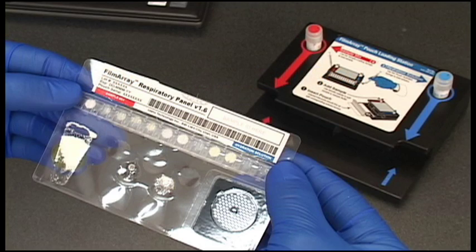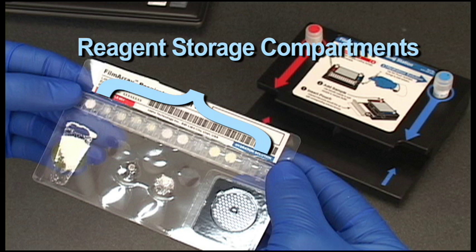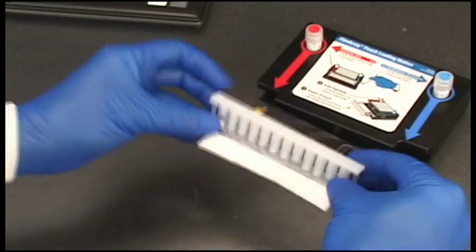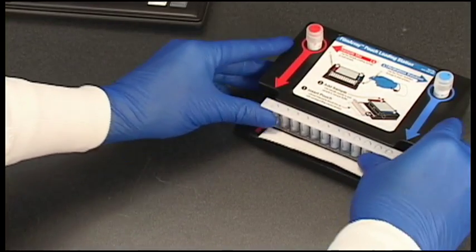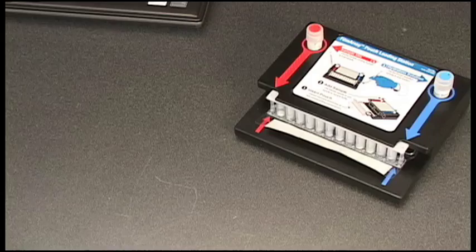Starting a FilmArray run is easy. All of the reagents required to test a sample are preloaded and freeze-dried into the reagent storage compartments of the FilmArray pouch. To begin a FilmArray run, the pouch is first placed into the loading block.